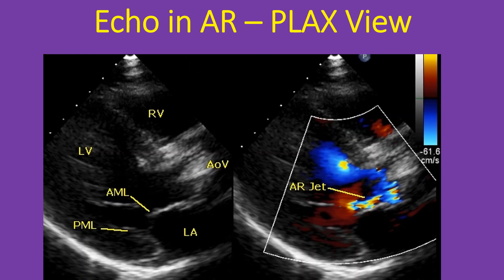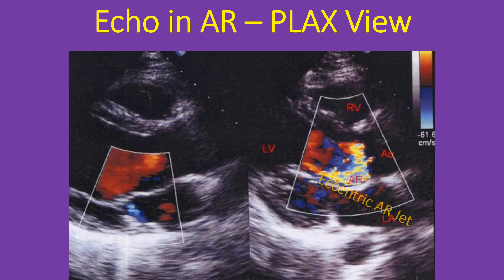This is a parasternal long axis view from another case. The aortic valve is seen as grossly thickened and calcified. The right panel shows the multicolored jet of aortic regurgitation along the ventricular surface of the anterior mitral leaflet. This is quite an eccentric AR jet, and hence assessment of severity will be difficult. Here is another eccentric jet of aortic regurgitation going along the posterior margin of the left ventricular outflow tract or the anterior mitral leaflet.